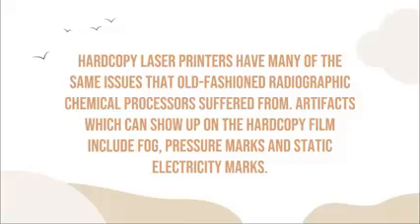Okay? Artifacts can result from placing the single side emulsion of the film upside down in the printer. So, di ba, ginagamit mo na ito pag print karon sa mga film, kumari, di ba, digital image man siya. So, if the patient asks for a hard copy of the image, of course, ang gamiton ninyo is film. Okay? Kaya kung papel lang na siya, pangit kaayo ang gawas.